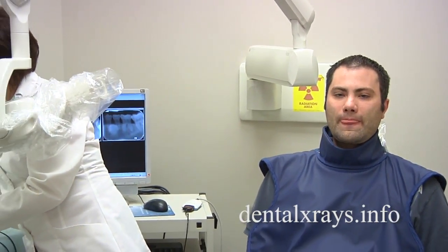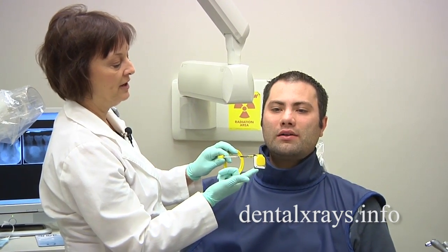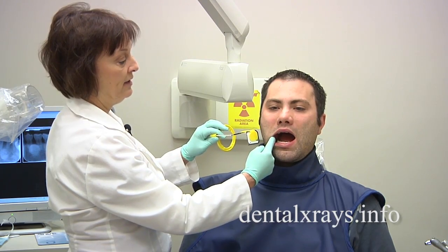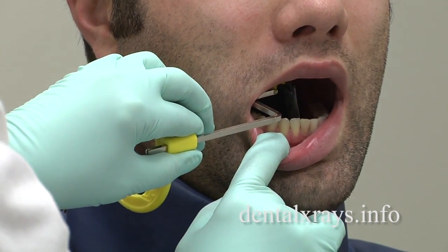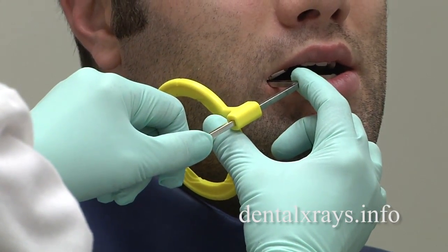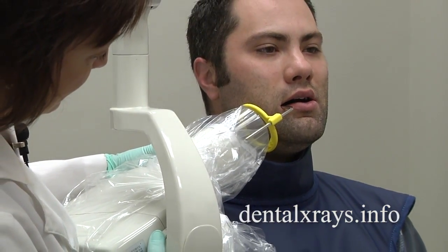If you're using the rings for the premolars, retract the cheek a little bit to accommodate this piece. Make sure that the edge of this film is right between the two tori — you can feel the large bumps. Retracting the cheek makes it a lot easier on the patient, and you can get the film in there while holding the cheek out. Put their chin down just a little bit, and you don't want this on the tori — right in between the two. Once you get it placed there, allow them to close, let go of the bar so it works its way down and they can close right onto the bite block. Slide your ring in, and because you have the ring system and bar which makes your vertical tube angle easy to set, follow the bar and put the cone in the same direction the bar is directed, and you should have a perfect film.